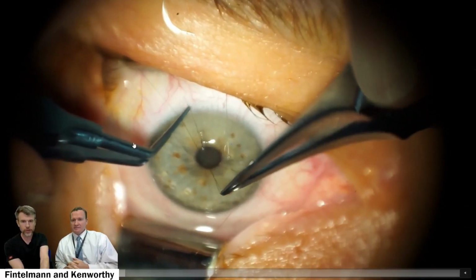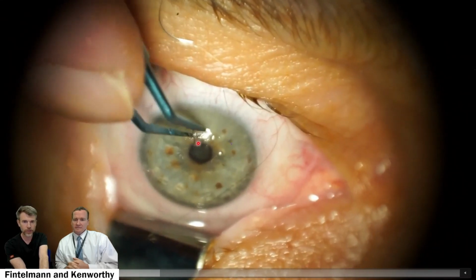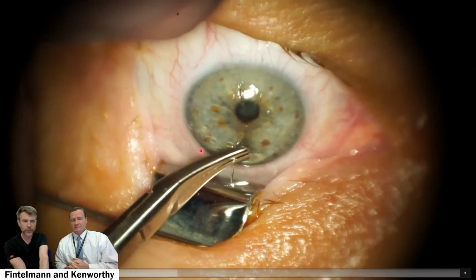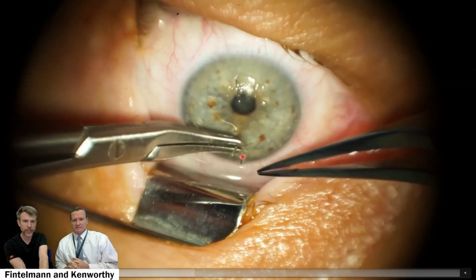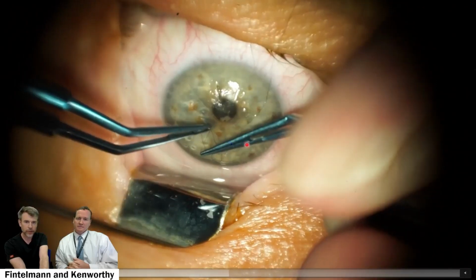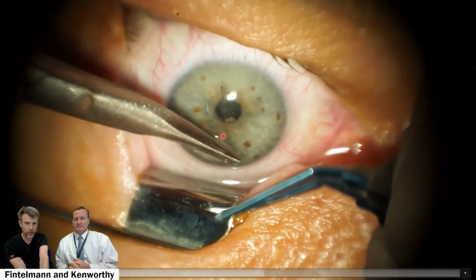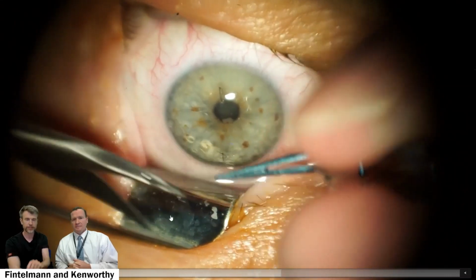I place sutures. This was a very small AK superiorly, so it's just one suture that goes here. All the knots I trim and rotate into tissue to make sure they don't irritate. On the bottom, because it's a little bit wider, I place two. Unfortunately, which makes things more difficult, there was an RK cut that almost went through the AK.